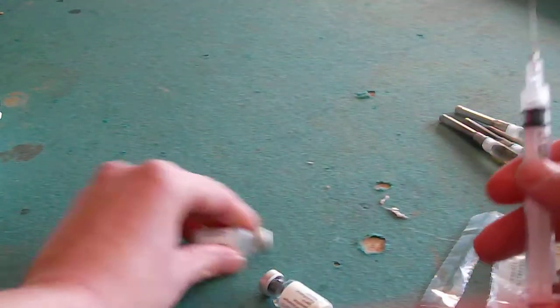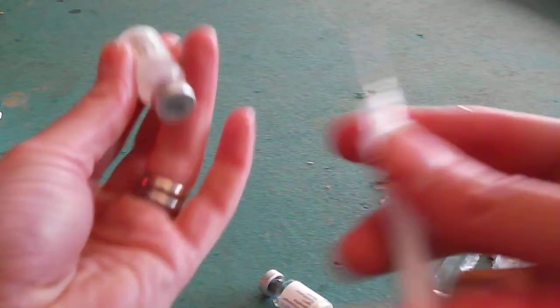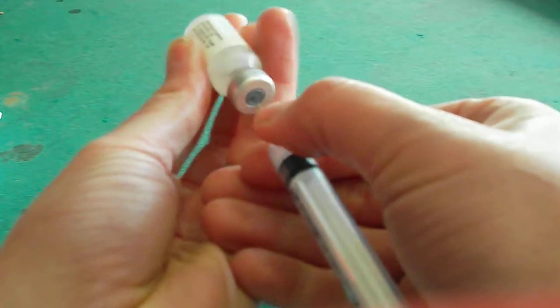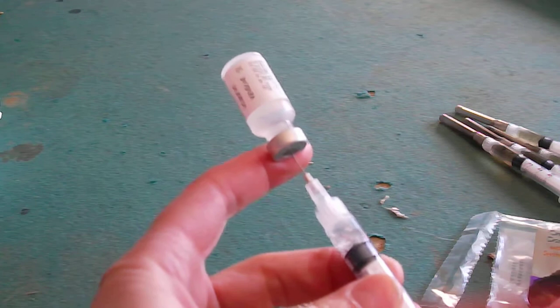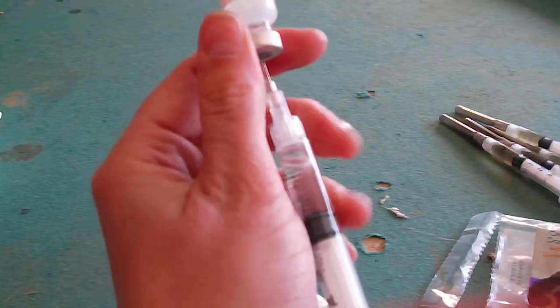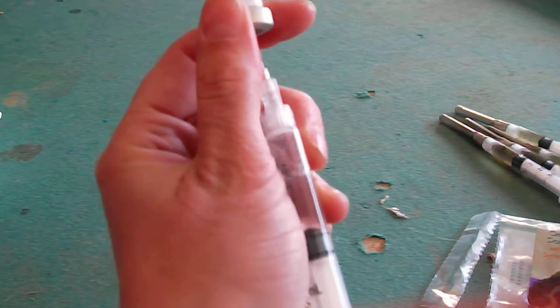Take the cap off the needle. Take the liquid. Insert the needle in. Draw it out. Get every last bit as much as you can.